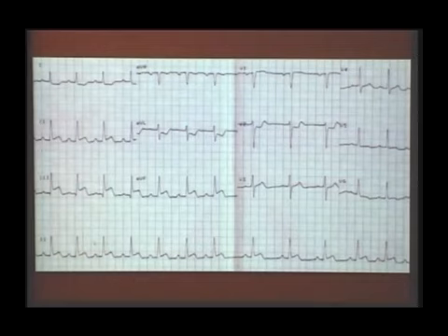You will not allow this R wave to go to a Q wave in inferior leads, which means you have allowed the infarct to happen and necrosis to happen. That is a permanent change. After that you cannot change it. So that is the importance of opening up an artery at this stage itself, and the importance of recognizing this particular ECG change.